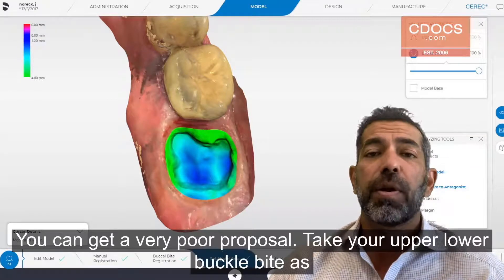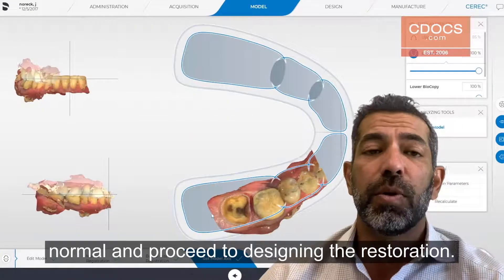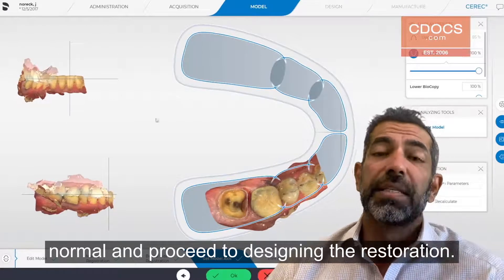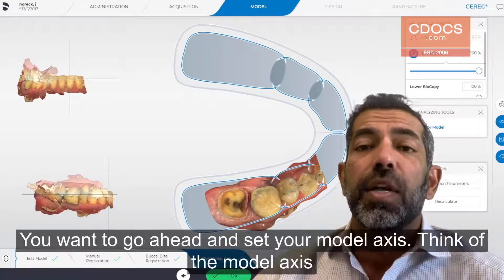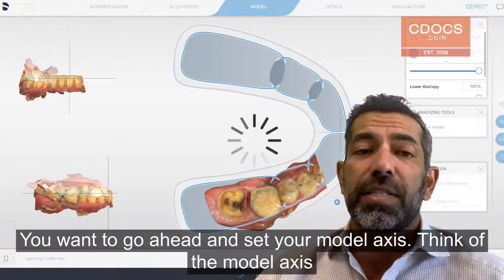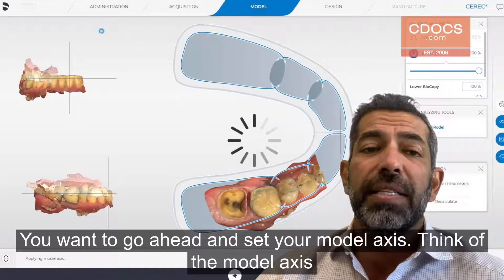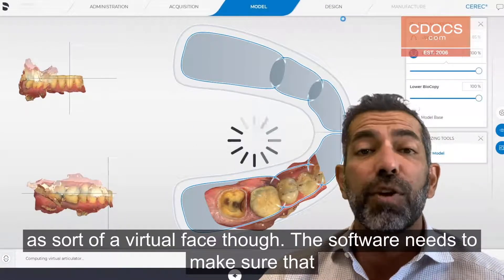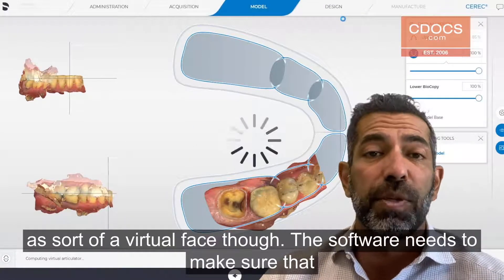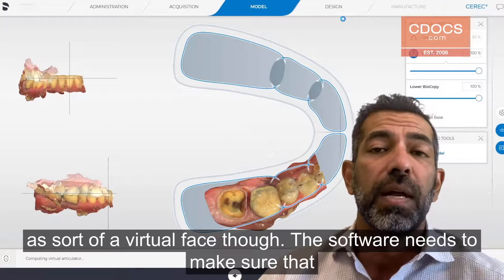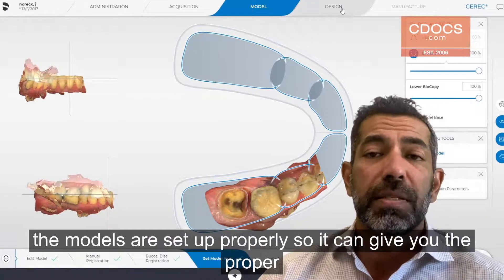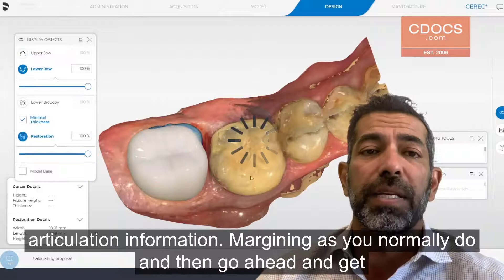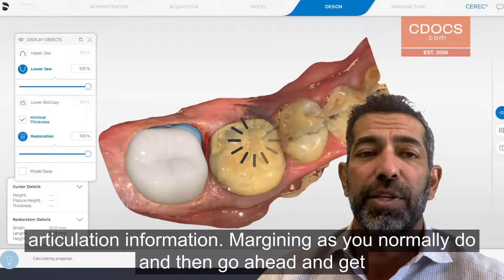Take your upper, lower, and buccal bite as normal and proceed to designing your restoration. You want to go ahead and set your model axis. Think of the model axis as sort of a virtual face bow. The software needs to make sure that the models are set up properly so it can give you the proper articulation information.